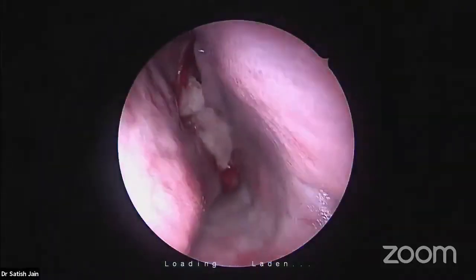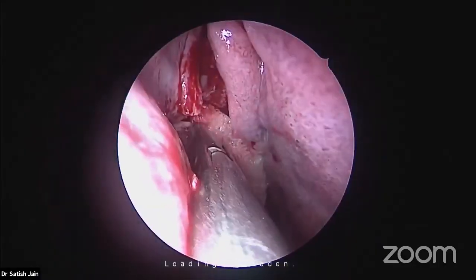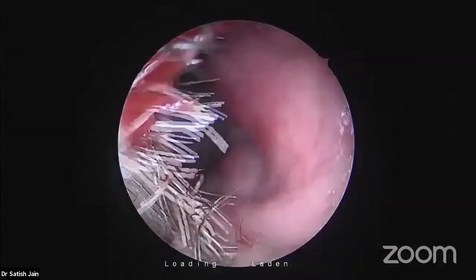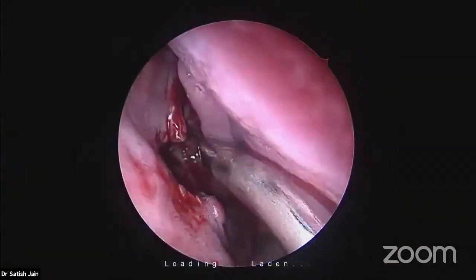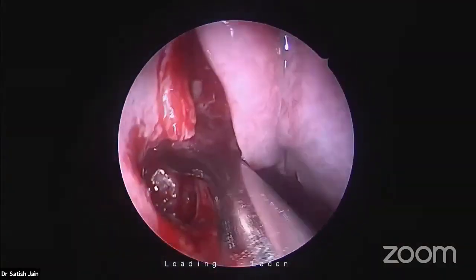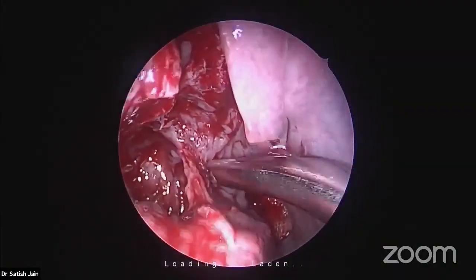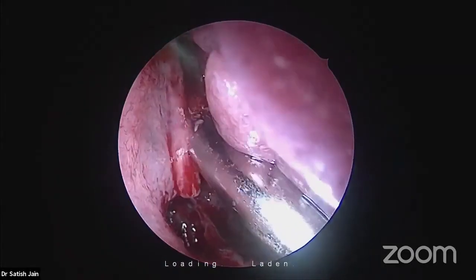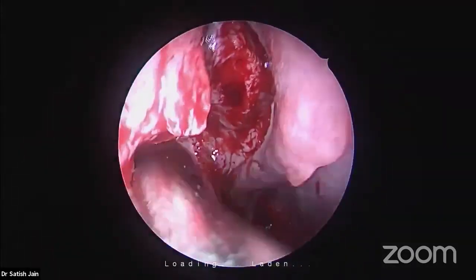And what about the inferior meatal antrostomy approach combined? Inferior antrostomy is now no longer practiced, with the advent of pre-lacrimal, sublabial, antrostomy and Denker's and all these approaches. Inferior is a blind procedure. You can traumatize, and it is never a long-lasting approach. So this is the first part, that is middle meatal antrostomy.